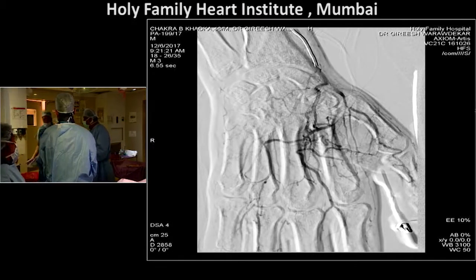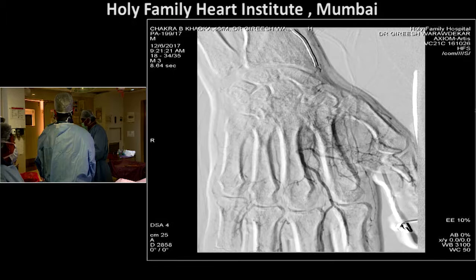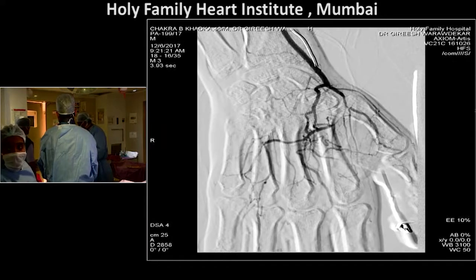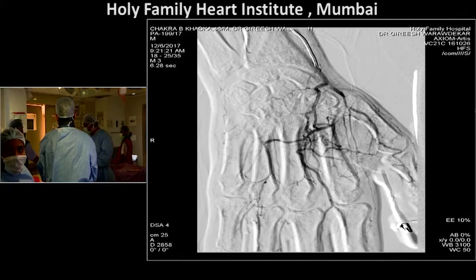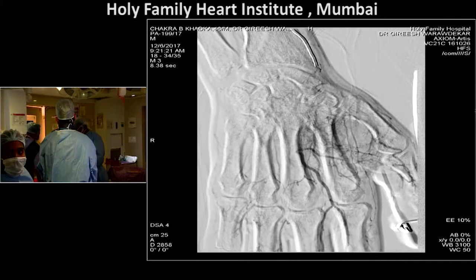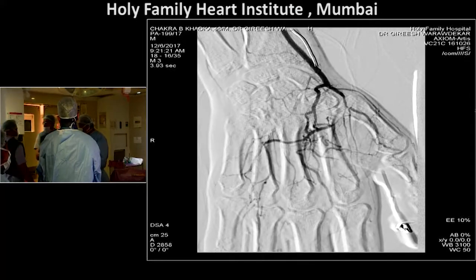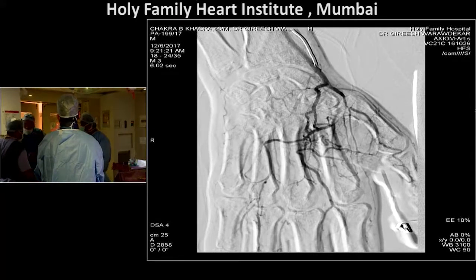Filters for preventing distal embolus, if you're worried about it. I'm just putting points across; we may have these kind of devices with us and we would like to use it. Here in this case it's a brachial territory. You may have it in the tibial territory. Would you use it with a single vessel runoff? Is there a role for a filter?